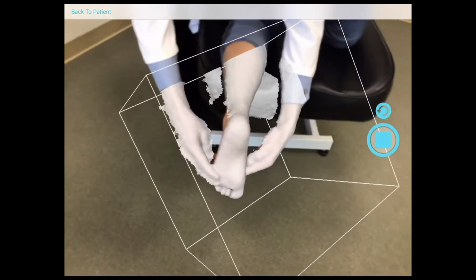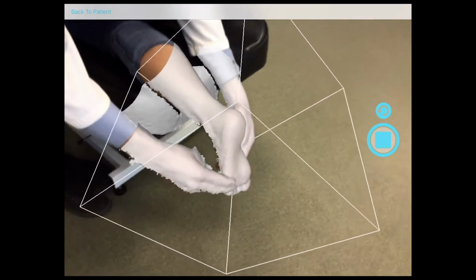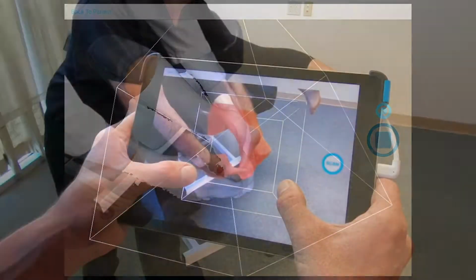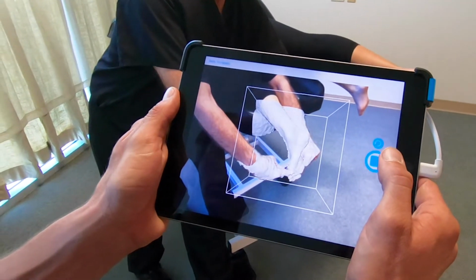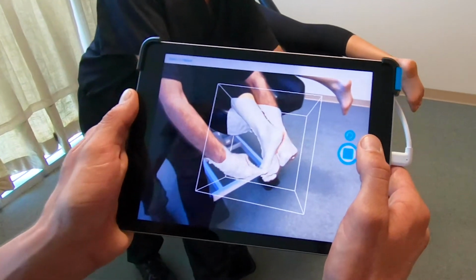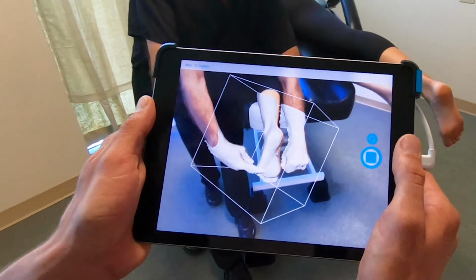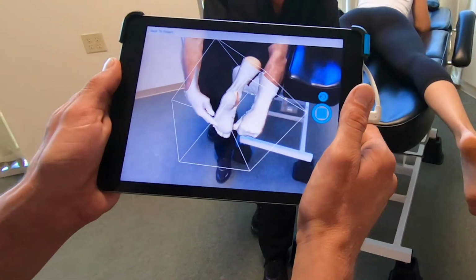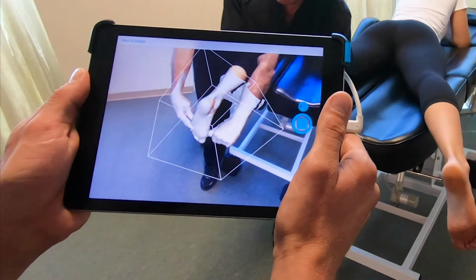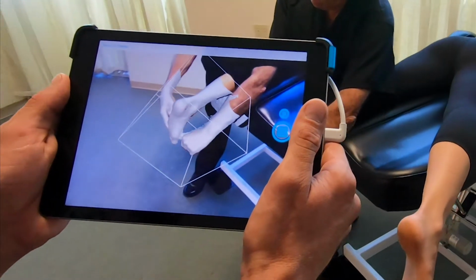When scanning for ankle-foot orthoses, be sure to include the entire foot and the lower leg up to the height required for the AFO you are prescribing. Now you are ready to scan. As the foot is being scanned, it will be painted with a white gradient. Slowly and steadily move the scanner, painting the object completely with the white gradient.